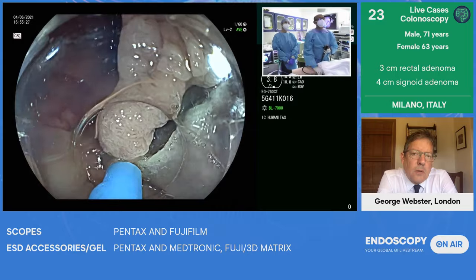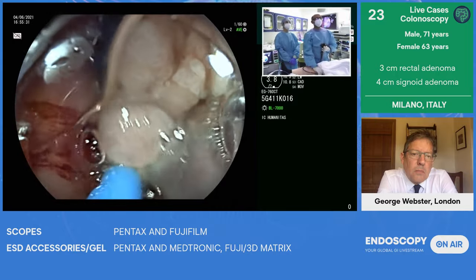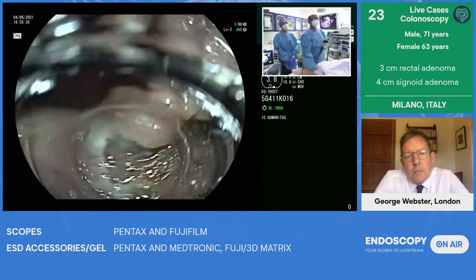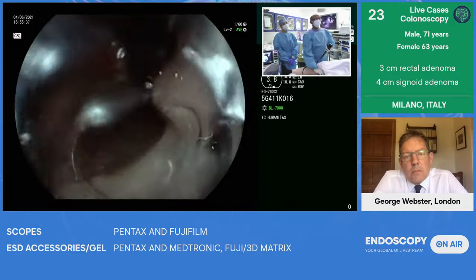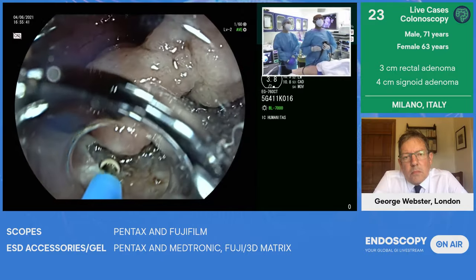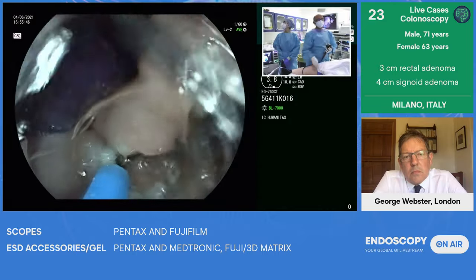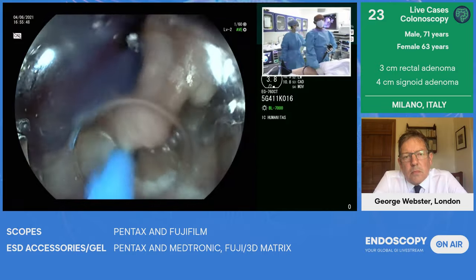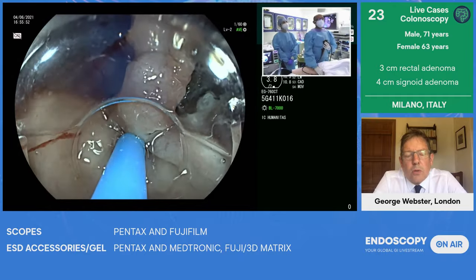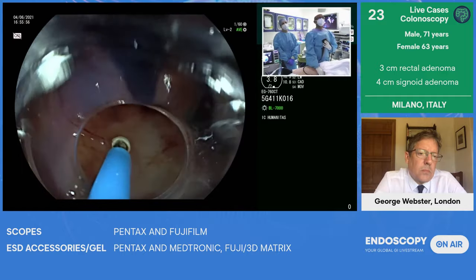But it just requires a good control in terms of direction. If we know where we're going, you hook this knife underneath with the ceramic ball pointing to the muscle, and that reduces the risk of damage to the muscle. But it does require traction. You see here, so I hook it in. You see there?